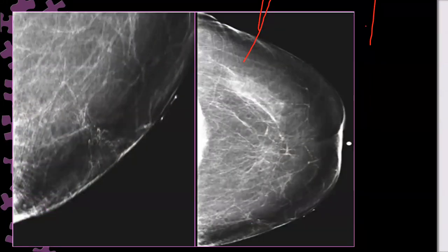And here, they make magnification. There is something here, a magnification artifact. Which type of artifact is this? It is not a motion artifact. Look, this is the artifact. This is related to what? Hair artifact? No, this is not hair. It is a lucent line.